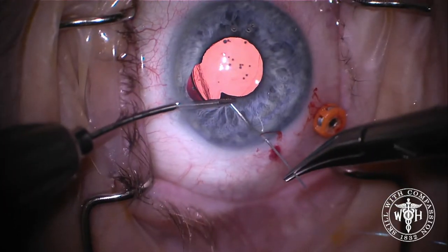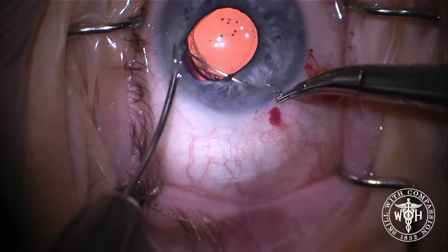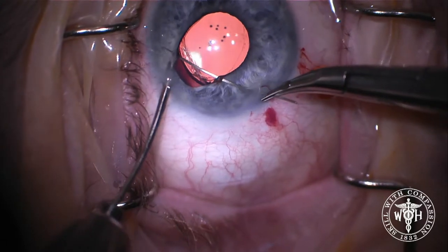Now we're going to bring the pupil down by using a miotic agent. In this case, I used Miochol. And you can see now the irregularity in the pupil border.